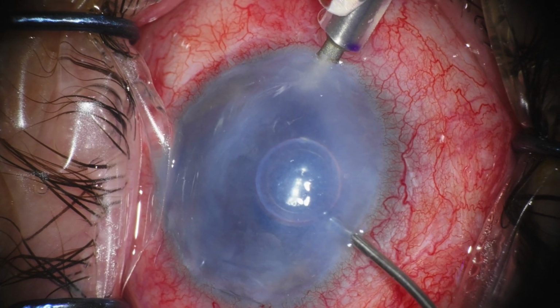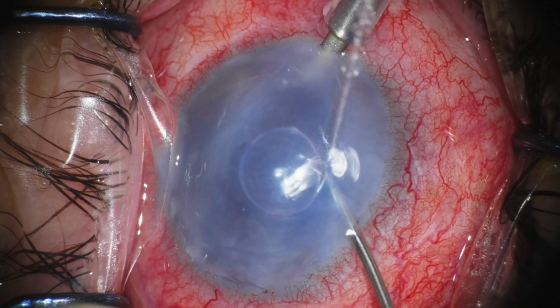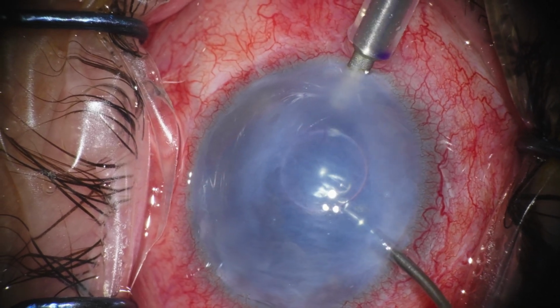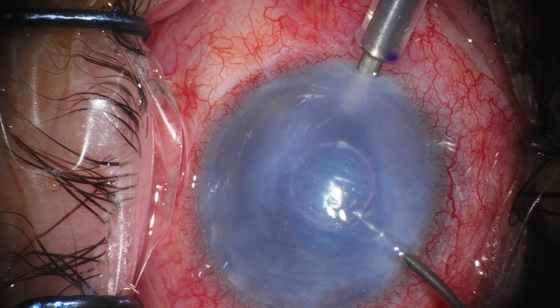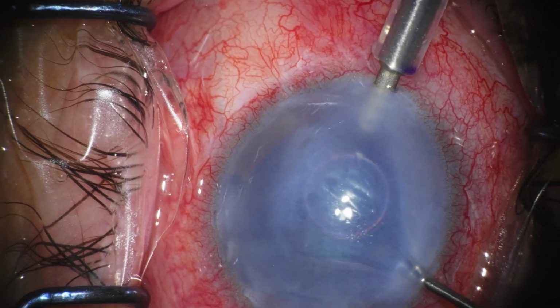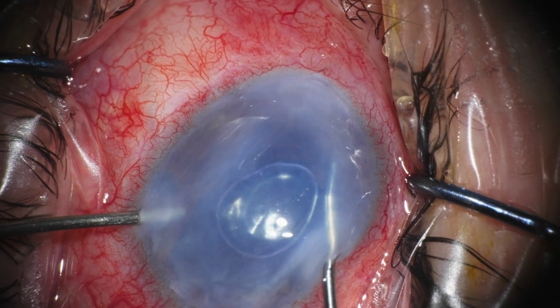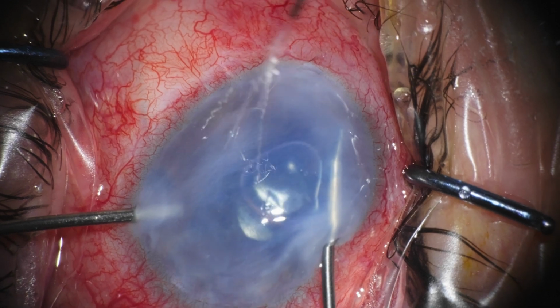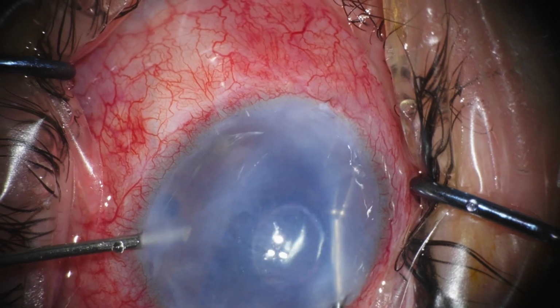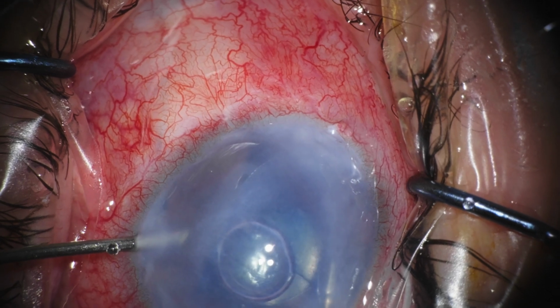So we've injected an air bubble underneath the graft, and now we're trying to use the maintainer to pull the graft to 12 o'clock, but maybe you're not sure if you caught that, but the graft started to flip because the AC was so very deep. In this case, we could have used a larger graft, like 10 millimeters, but we don't have access to trephines that are that big, and sometimes even the donor doesn't allow you to punch to 10 millimeters.